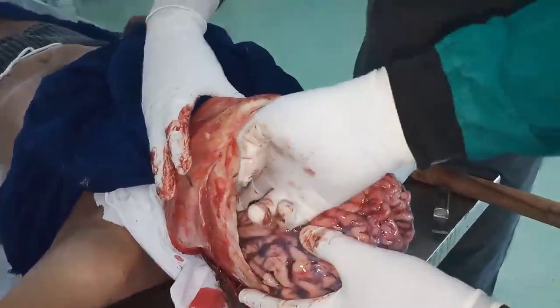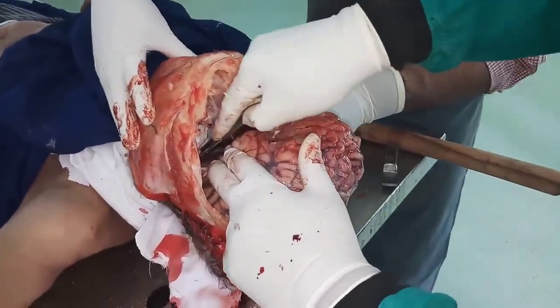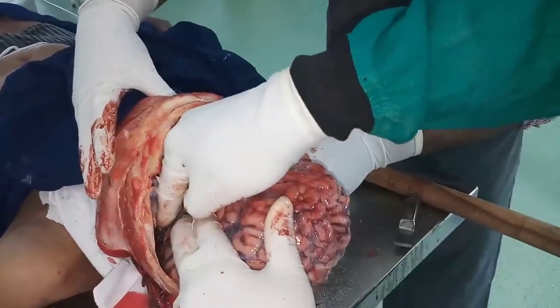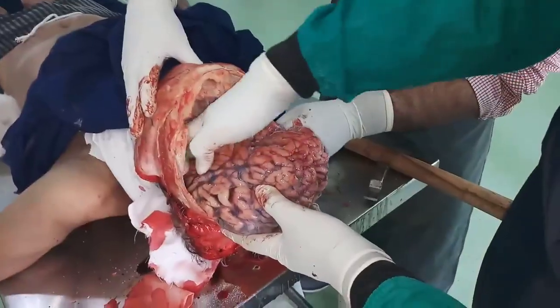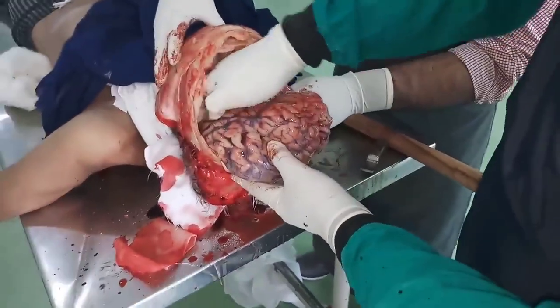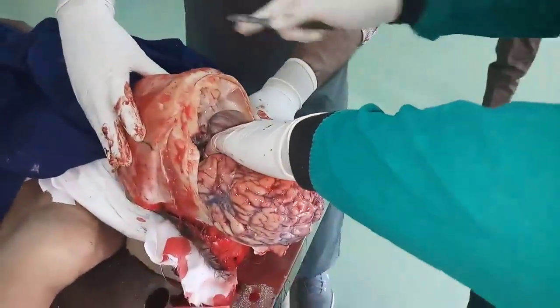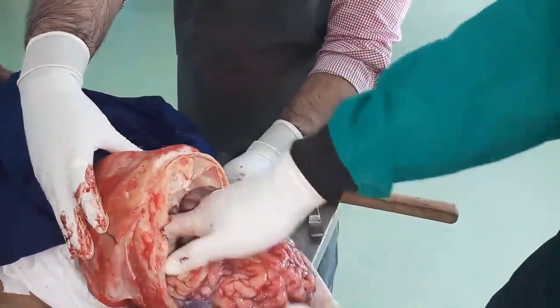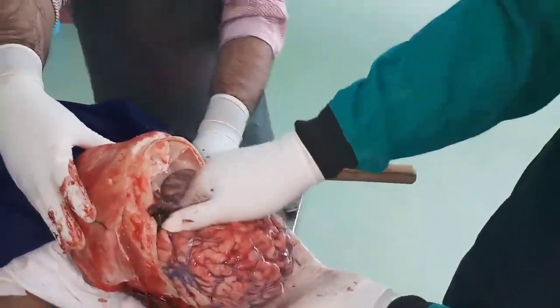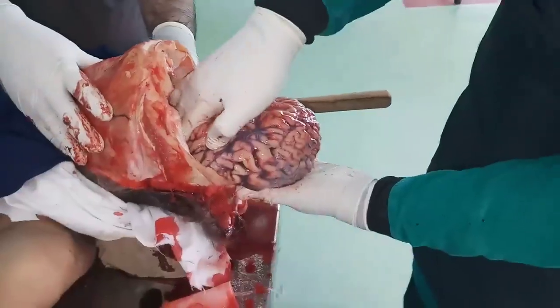Now with the finger I will just try to remove. No, the tentorium cerebelli is still intact. We have to give a cut over the tentorium cerebelli on this side. With the finger I am removing the cerebellum. Now on the other side again the tentorium cerebelli is still intact. It has to be cut. Now with the finger I am removing the cerebellum of this side. Now the cerebellum of both sides is in my hand.